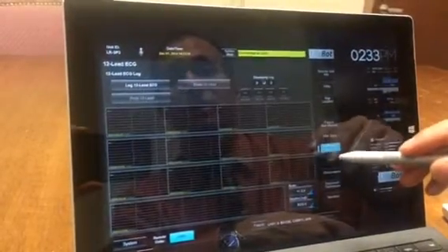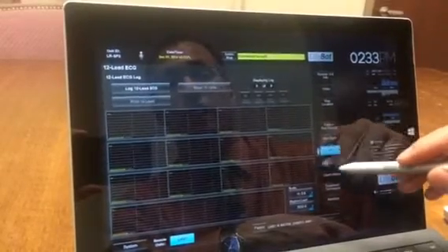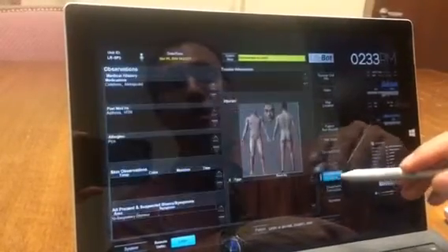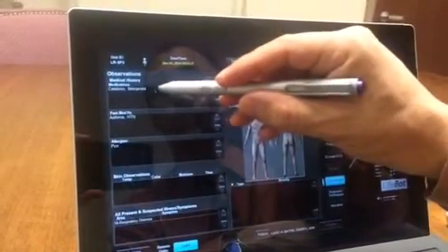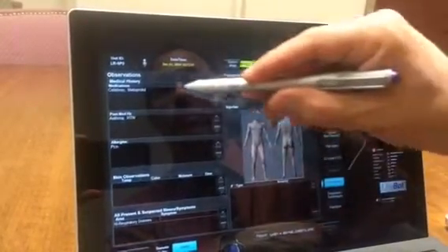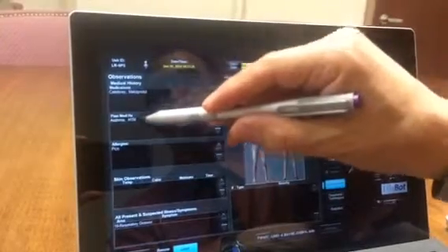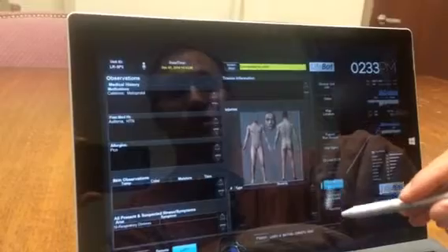The other button is your 12-lead EKG, which if this was a real patient, we would have a full EKG set for you. Observations will have the medical history. They will include the medications, past medical history, allergies. They will have that all inputted for you. As you can see, this patient has Celebrex and metoprolol, asthma, and hypertension as its past medical history.